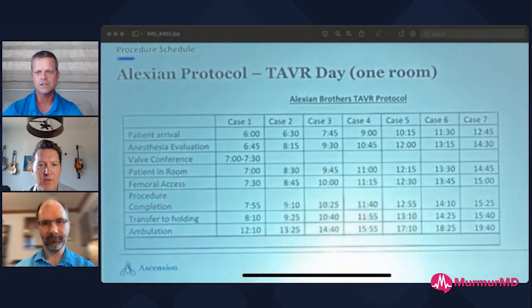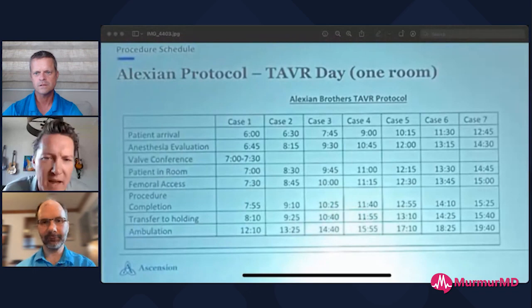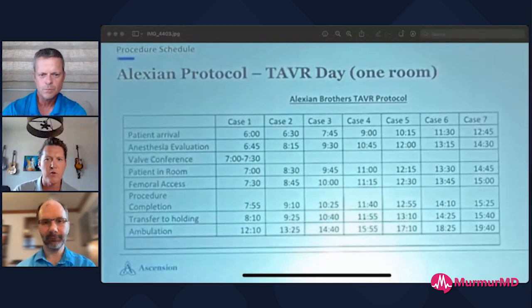And I think we all, with our respective structural heart programs, struggle with this and how to have an efficient workflow, how to get TAVRs done in time so everyone goes home and sees their families before 4 or 5 o'clock. And we wanted to take some time with Andrei and just talk about how he's able to accomplish 7 TAVRs in a day by 3 o'clock. So Andrei, let's start by pulling up Andrei's TAVR workflow. Can you take us through this, and then we can talk a little bit about some of the tactics you've used to achieve this remarkable efficiency?